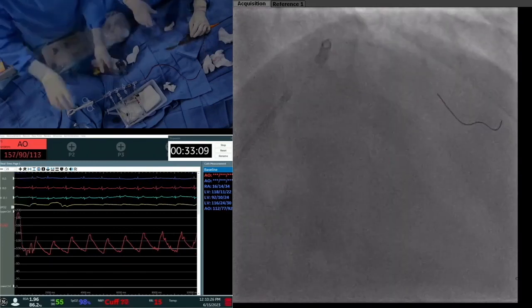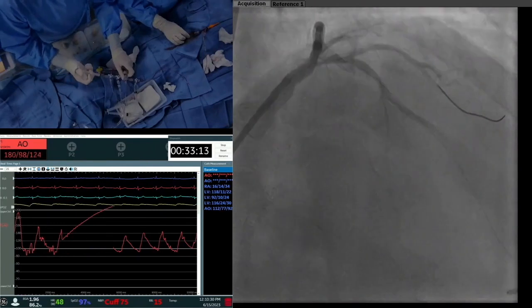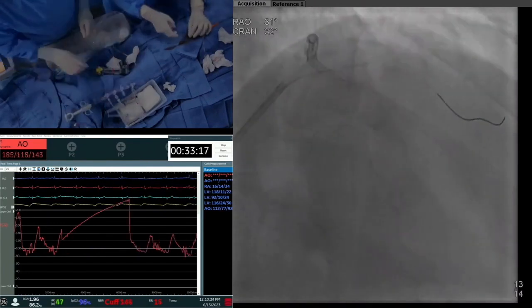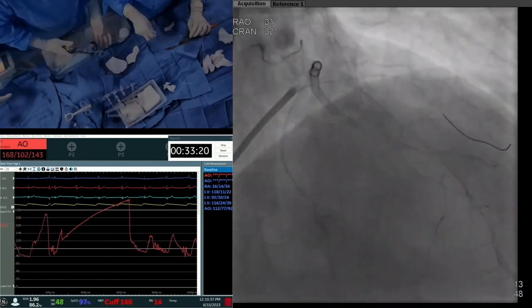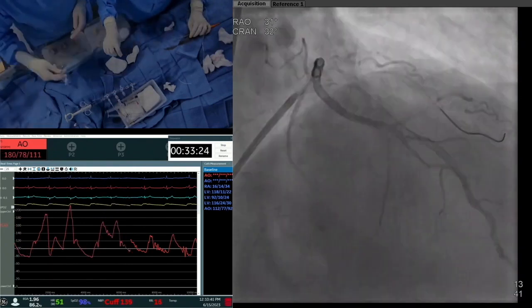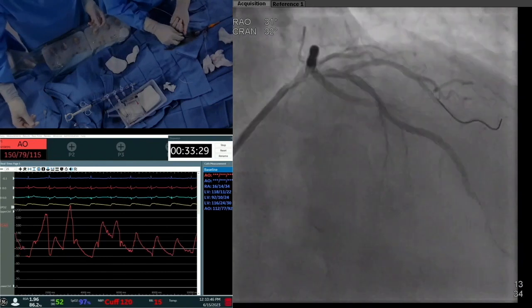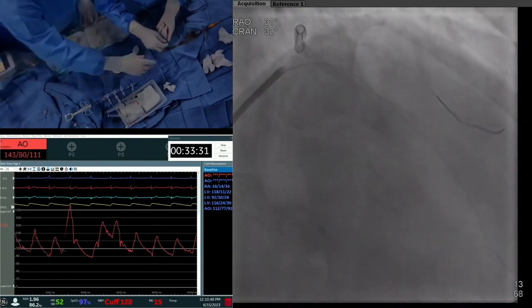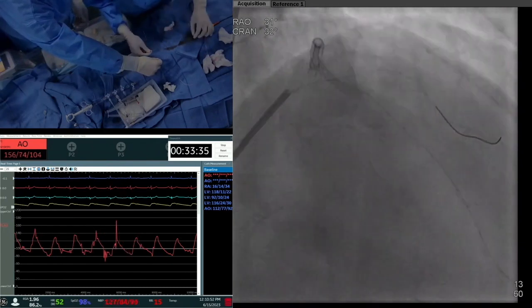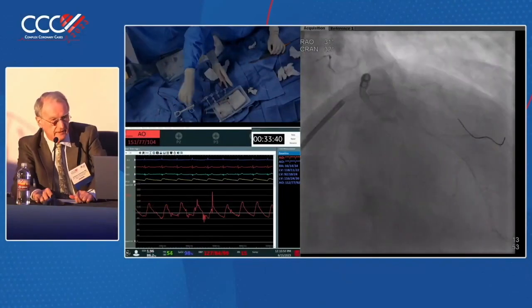okay, now let's take an angio. Okay. So now what would you do, Antonio, since you're doing provisional? You think now you could probably get away with a single stent? I'll do kissing balloon on the LAD with the 2.5 non-compliant for the diagonal and the 3.0, maybe 3.5, for the LAD. And most probably going to do DCB on the diagonal and stent on the LAD.